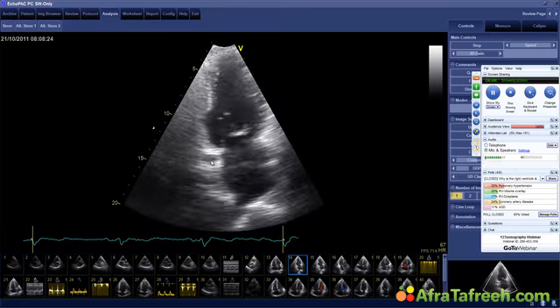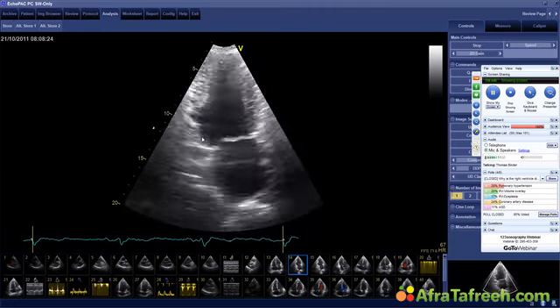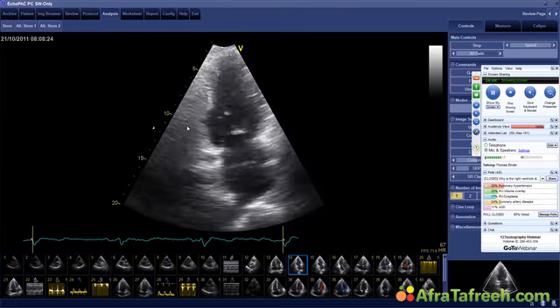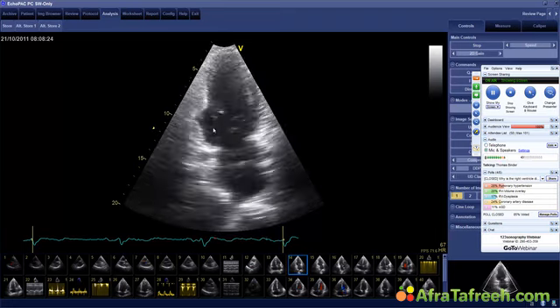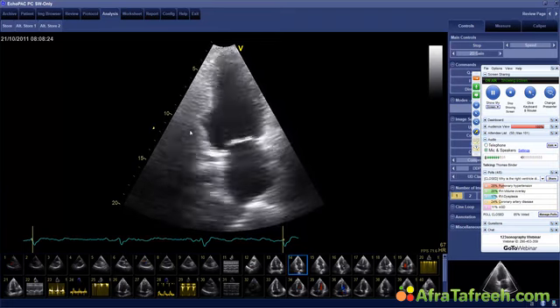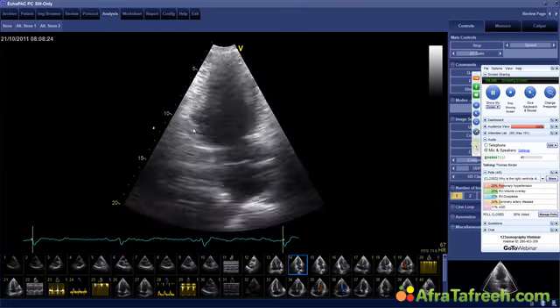This was the event that I talked to you about when I showed you the history of the patient. And the patient was actually pretty lucky because he had an aneurysm here, and he almost had a rupture of the inferior wall. So, Alain, you correctly answered this, and you correctly made a good comment. Yes, it is an aneurysm, what you see here. And the interesting thing is that such aneurysms are more rarely seen in the inferior wall, but you can see them. And this is a patient where I would really be afraid that there is rupture.